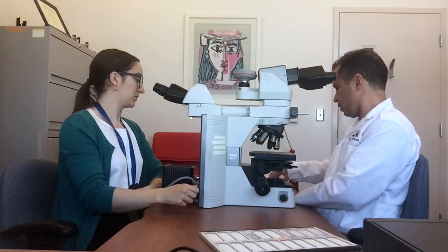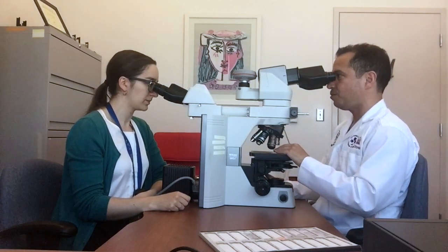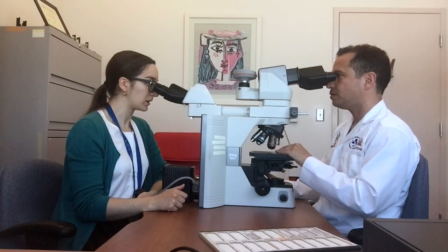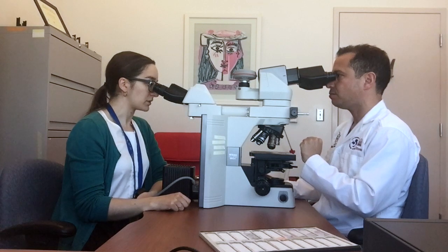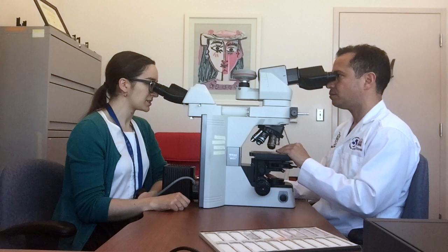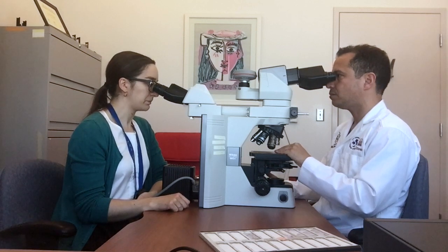Okay, so it's a core needle biopsy. So we agreed that we would pay attention to those today. So tell me, what do you see? Okay, so there's 5 fragments of tissue, and most of them show reactive lung tissue, but the center fragment, that one right there, shows something different. So what I'm seeing is some fairly atypical epithelium, lots of mitotic figures, some overt atypia, and I also see that they're forming glands. So to me, this is an adenocarcinoma.